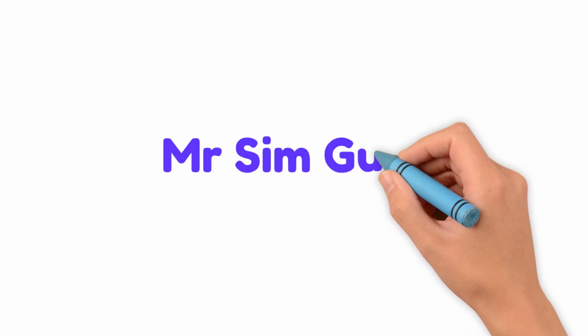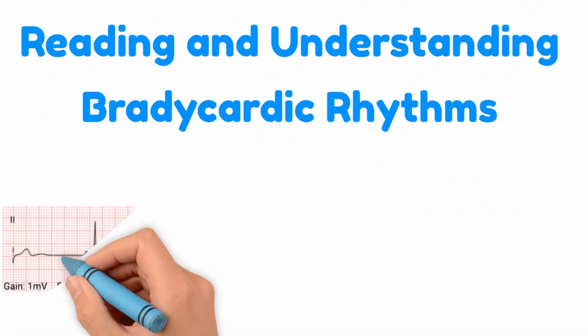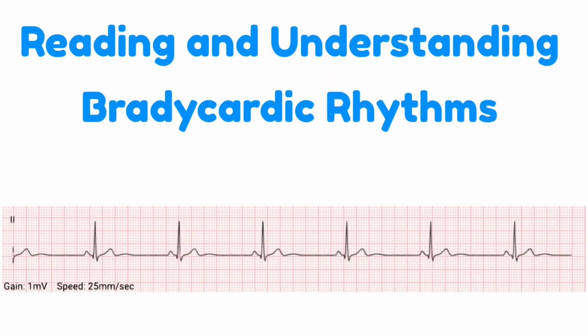Hey everybody, it's Mr. Sim Guy back again with our next episode on reading and understanding bradycardic rhythms. Here we will break down several different types of bradycardias in a way that's easy to remember.